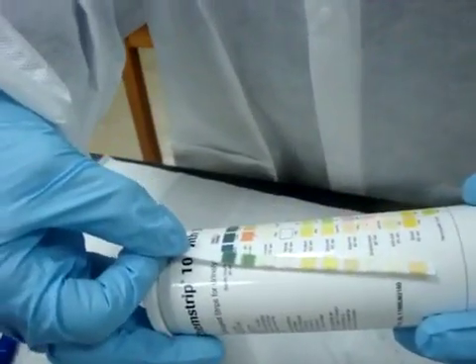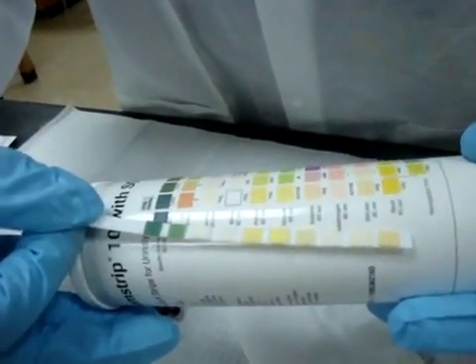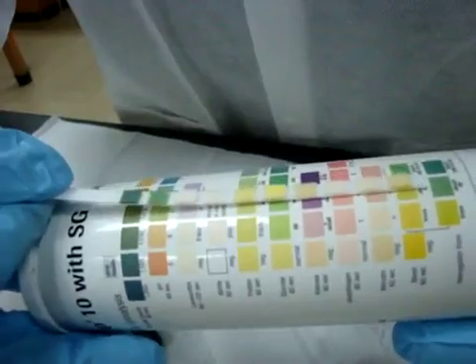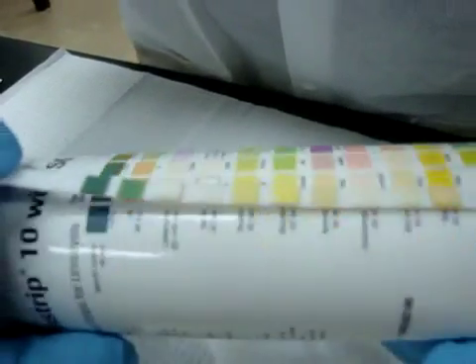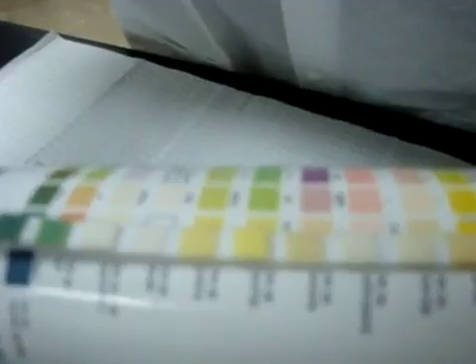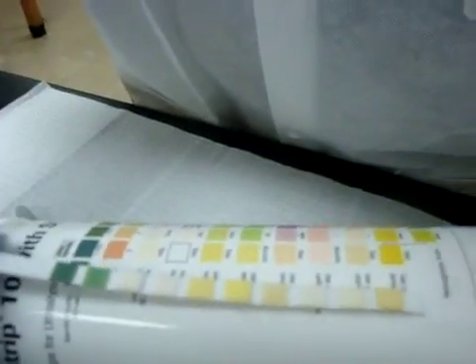It has been 60 seconds, so I want to start reading. We don't read specific gravity with the stick. We read that with our refractometer. But the pH, I match it with the closest color. You can see that the pH will be a pH of 8. Then the next one is leukocytes. I need to wait 2 minutes for it, so I will skip it. The third one is nitrites. Notice there's no pink color, so it's negative.